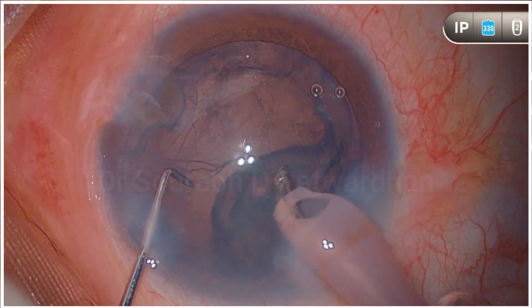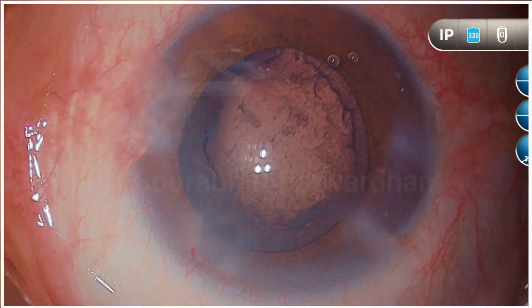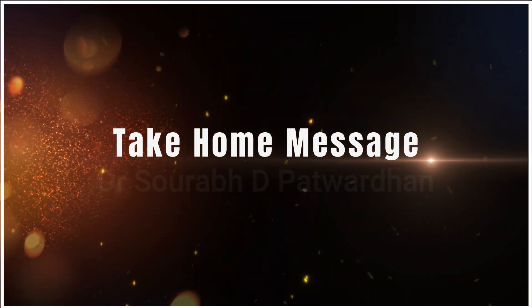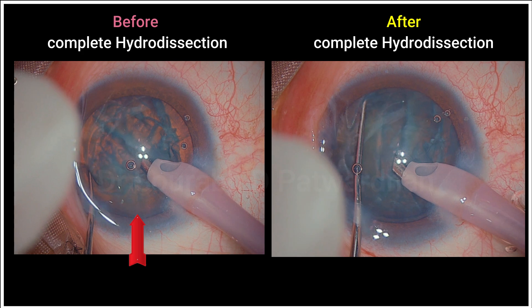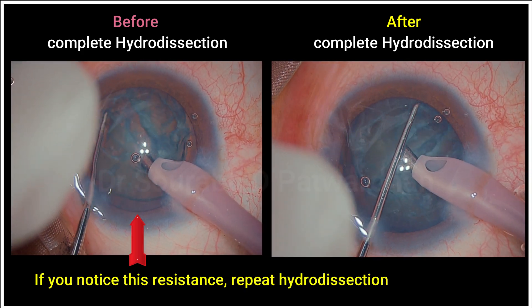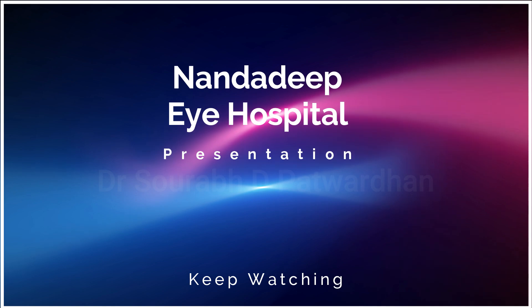So, what is the take-home message from this video? Always do good hydrodissection to begin with, but there are cases where you find that the hydrodissection is incomplete — that is when you find more resistance while rotating the nucleus. If you notice this resistance, always repeat hydrodissection. You will find that if the hydrodissection is complete, the rotation of the nucleus is effortless. Thank you.